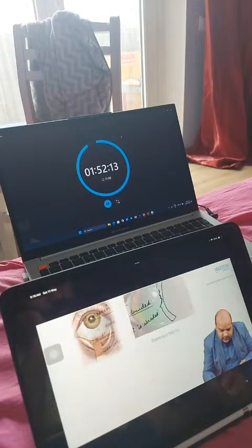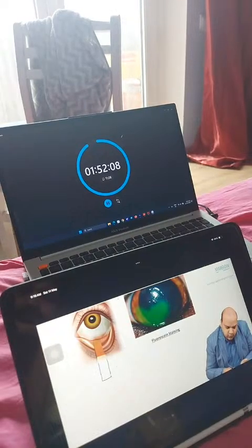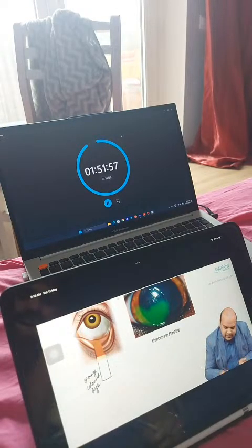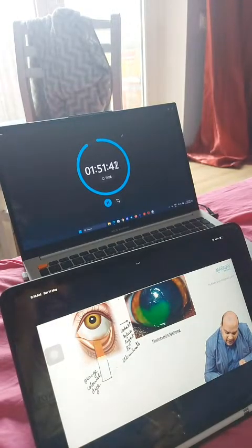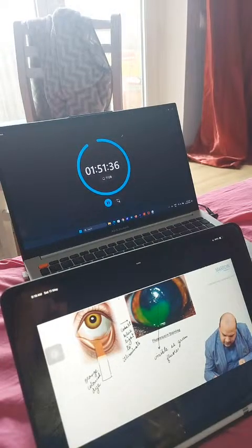Now, this is a strip of fluorescein. So let's say this is a complete white strip of fluorescein with an orange tip. So it is an orange colored dye. Okay, we take a strip, we put it into the lower fornix, we stain the whole cornea or the surface of the eye. Then, if you see, we use cobalt blue light to illuminate. Okay, after we have illuminated this by cobalt blue light, everybody, wherever fluorescein dye is able to stain, those areas are visible as green fluorescence.